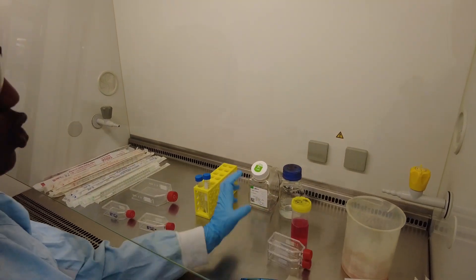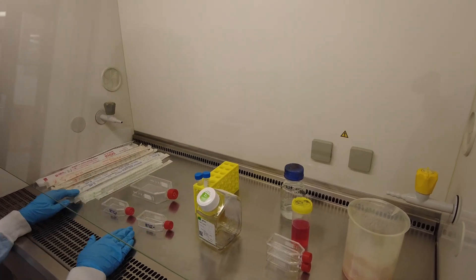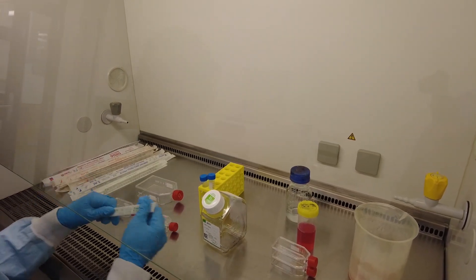Then we're going to add trypsin. Trypsin is going to help lift the cells off of the bottom of the flask. I'll put about two milliliters into each of trypsin.